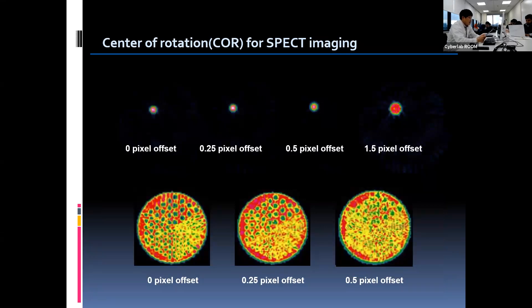The errors in these images are caused by COR offset. The images on the top are acquired with a technetium point source in SPECT acquisition. The image on the far left has no COR offset error, which is the best. The images with 0.25 pixel offset error are still acceptable. However, as the COR offset error increases, spatial resolution deteriorates significantly, and even the point source appears as a small ring with a large COR offset error, as seen in the image on the far right.